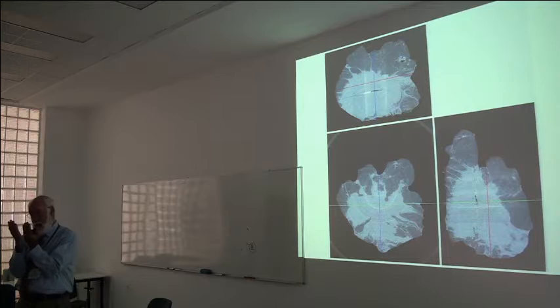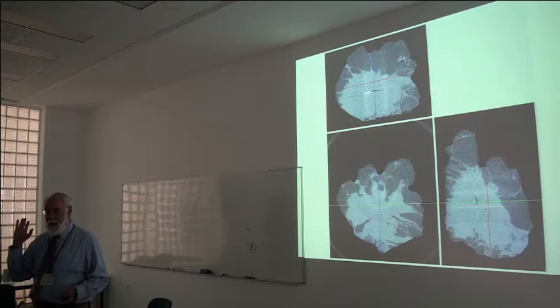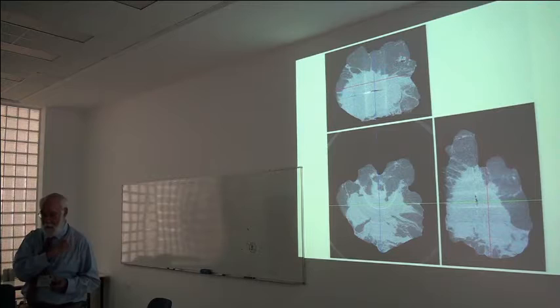And now we're doing an exact comparison between the slide and the micro-CT to see whether all these years when we've been talking about the reason why you see a breast cancer on a mammogram is because of that difference. I should say that this is what we call the low-hanging fruit, because we know mammograms see breast cancer.